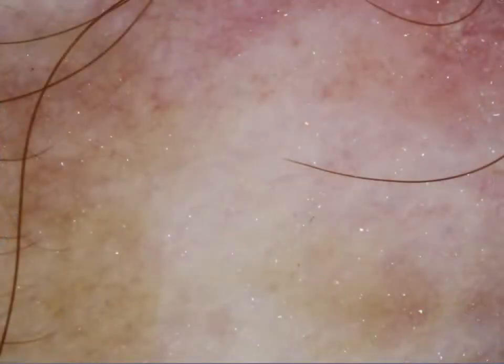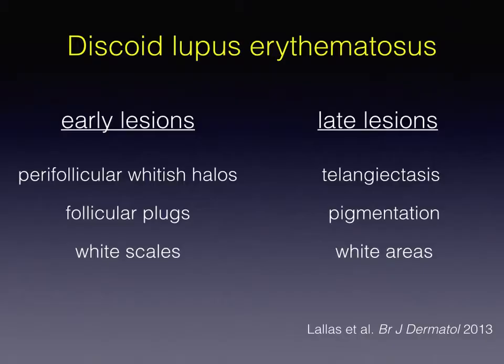In late stages, pigmentation structures may also appear. Finally, end-stage lesions dermoscopically display nothing but white structureless areas corresponding to diffuse dermal fibrosis. To sum up, early lesions of discoid lupus are dermoscopically typified by perifollicular whitish halos, follicular plugs and hyperkeratosis, while late lesions display telangiectasia, pigmentation structures and white structureless areas.